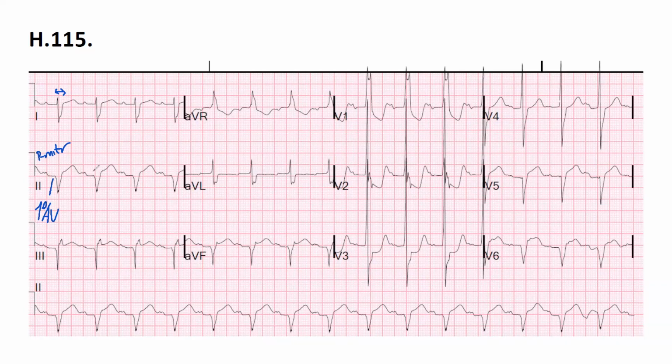Don't fall asleep. Okay, it's wide. What does it mean? You do have a supraventricular impulse formation with an intraventricular conduction problem. You have to look at V1 and V5, V6. Whenever you do see the notched R wave or a wide R wave, the block is there. So what do we have here?